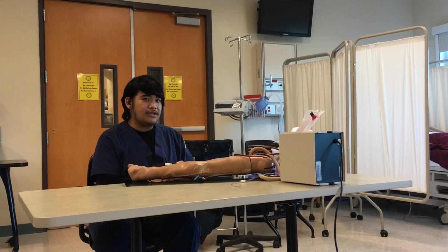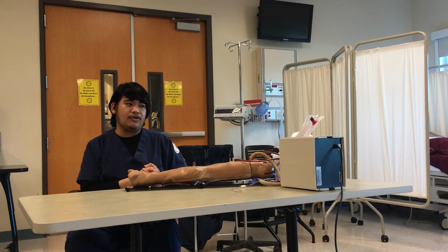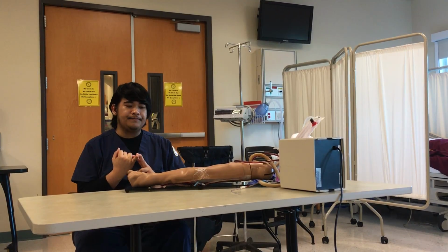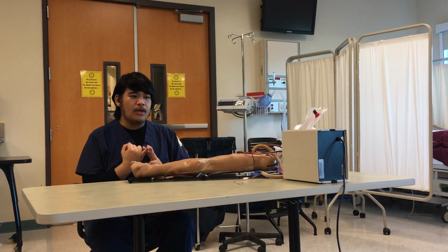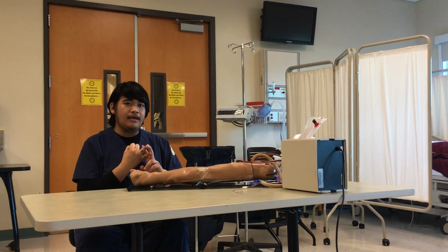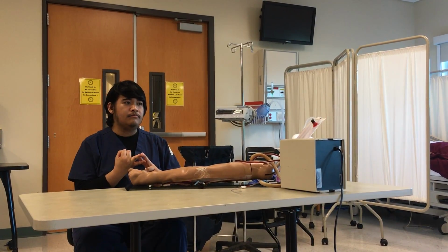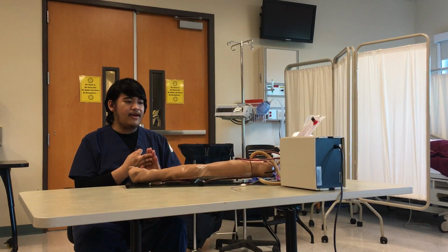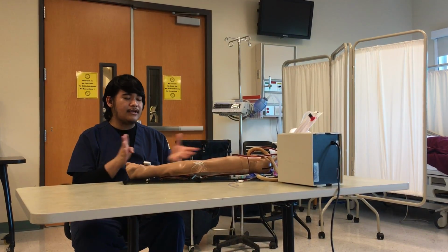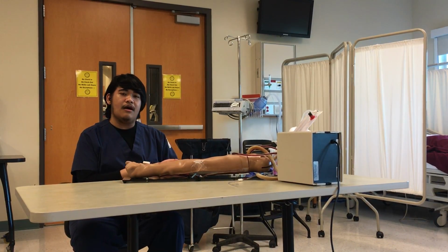After that, I would check the patient's chart and make sure I see the vital signs for trending, any anticoagulation or anticoagulant therapy, the patient's FiO2, and what kind of oxygenation device the patient is on.